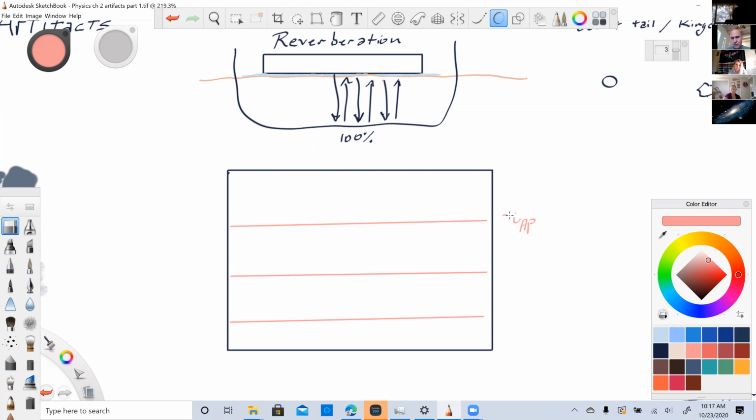So let's call this real, fake number 1, fake number 2. The first echo going back is real. Fake 1. Fake 2. So that should make some sense.